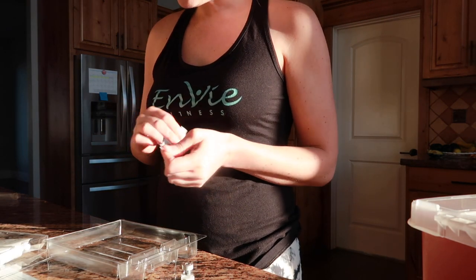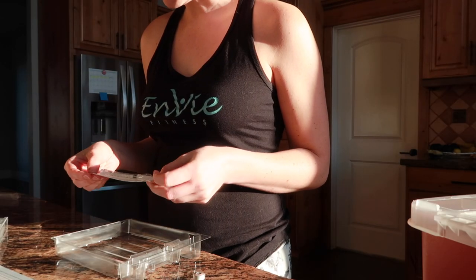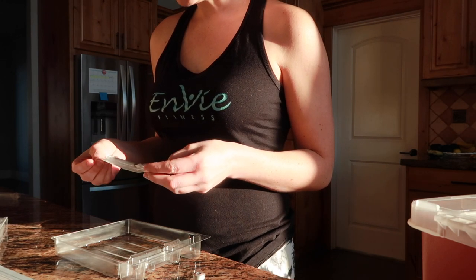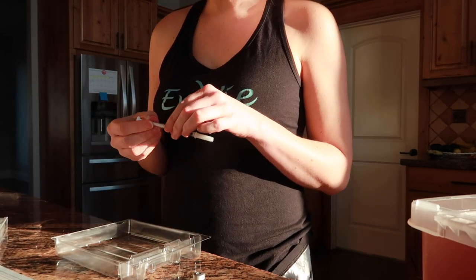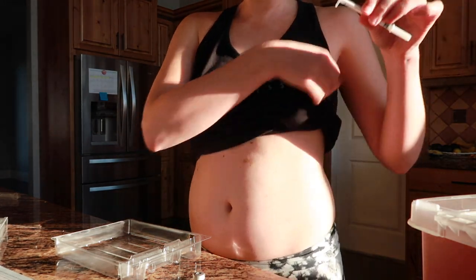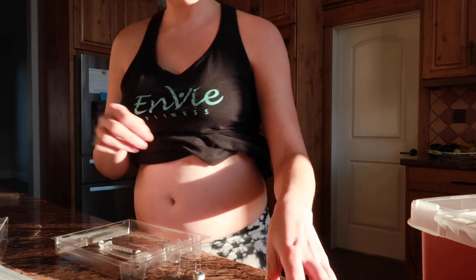Wipe the rubber stopper of the vial with an alcohol swab again. Remove the wrapper and carefully pull the needle cap off — do not touch the needle or allow it to touch any surface. I'm pretty sure I'm supposed to do an alcohol swab on my belly too before, so let me do that.